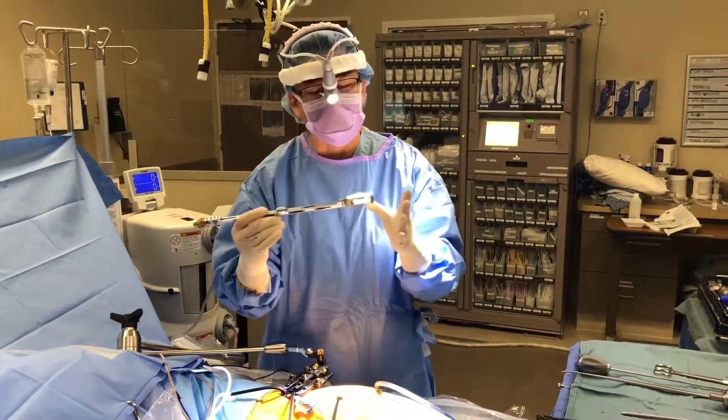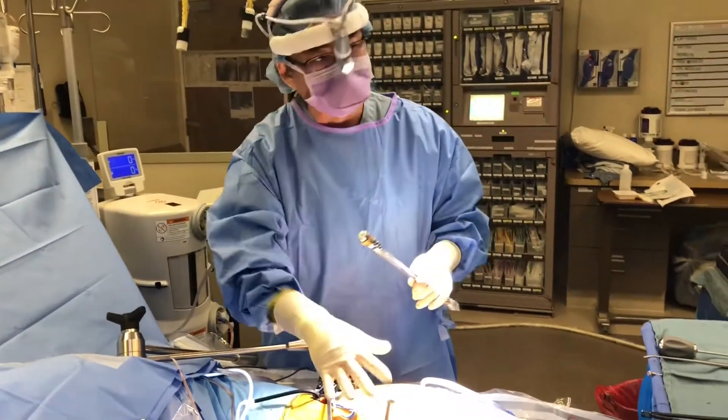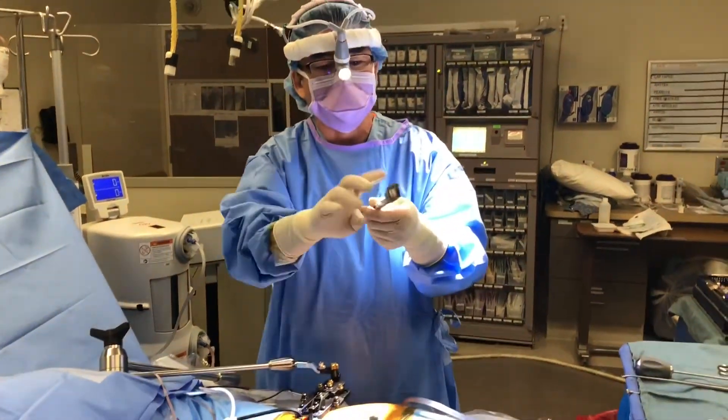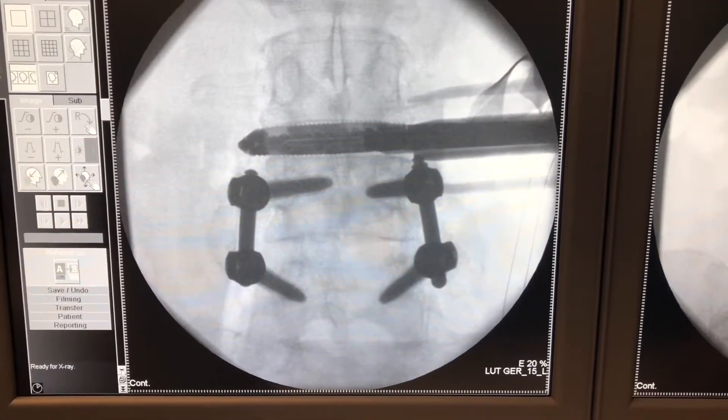The surgery is going very well so far. I'm ready to put the implant in — I already have the retractor and I've been using navigation to make sure I'm perfectly in the right spot. I'm going to put this in and then slowly expand it. This thing is like a carjack. With the cage in place, I can now turn the wheel and expand the cage.